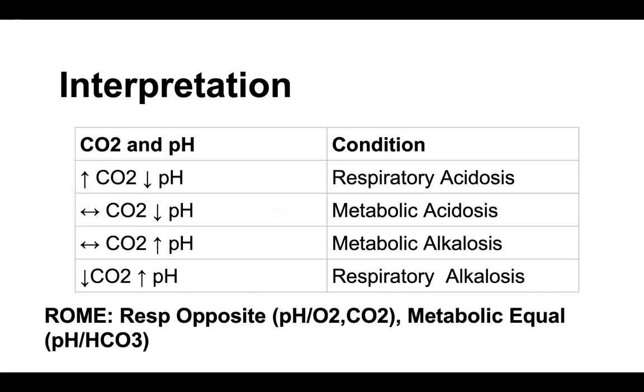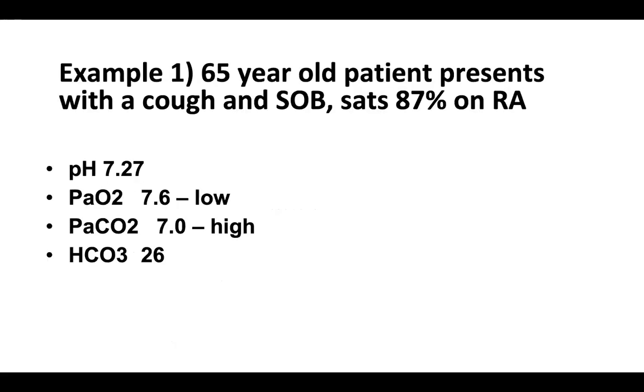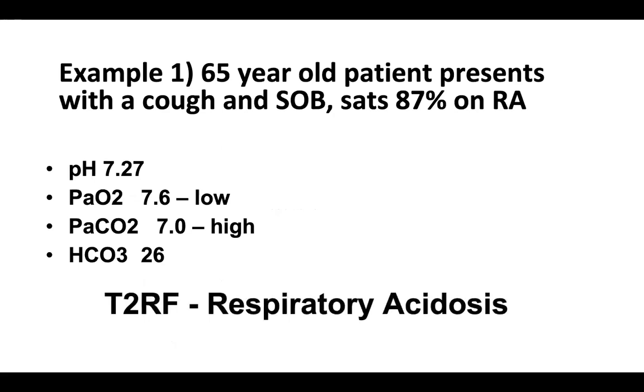to correct that. So in terms of which Venturi mask you switch on, if you go back to the diagram of the oxygen flow devices. I'll try to go back, can I? It's not letting me.